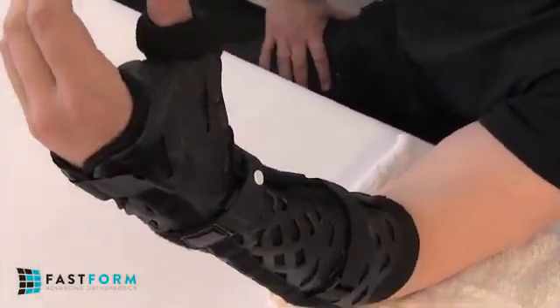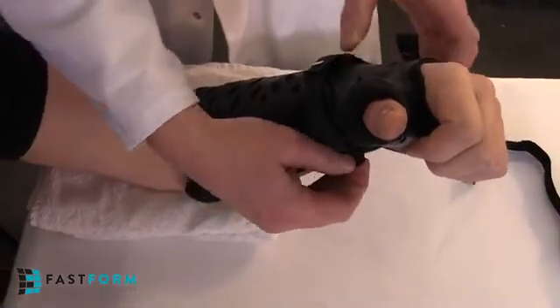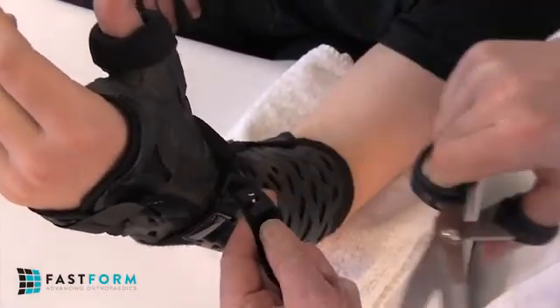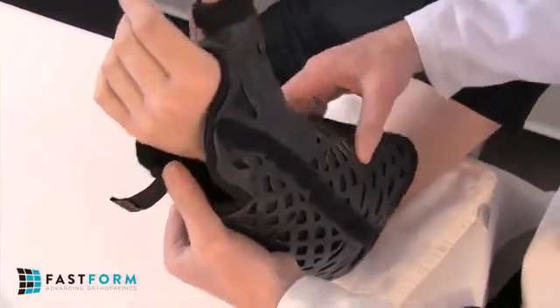Properly tension each strap for a snug fit. It is not necessary to use a saw to remove the thumb spica. Simply release the palmar cuff tab and straps. If the compliance lock is engaged, cut the compliance fastener peg with scissors to remove. Then flex open the overlapping wings for quick and easy removal.